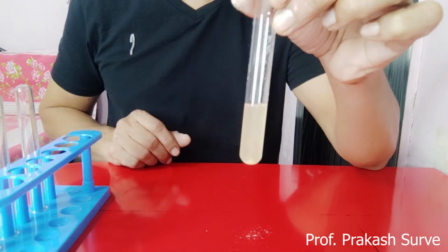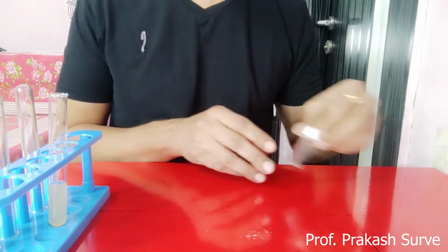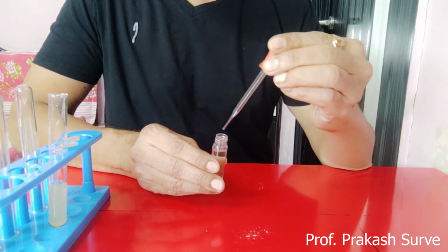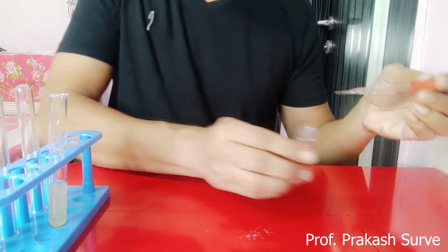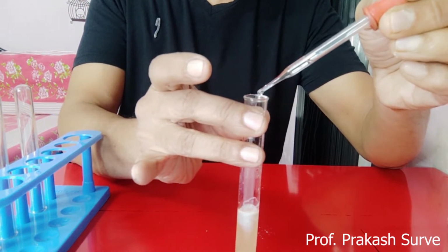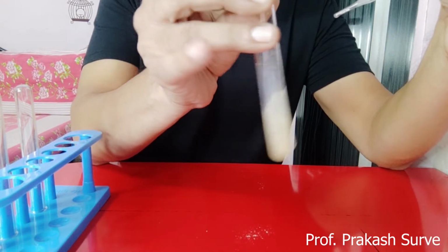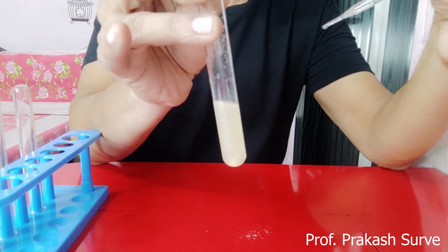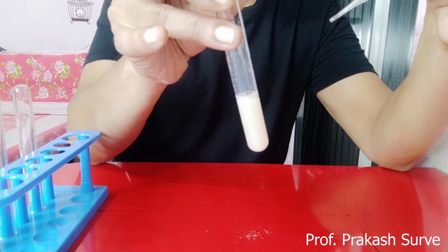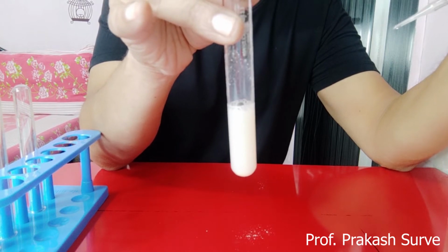Now in this I will add a few drops of the phenolphthalein indicator. Few drops means 1 or 2 drops. So here I will take the dropper and add 1 or 2 drops of the phenolphthalein indicator. Then we'll shake it and see what result we are getting. We'll keep it for a few minutes. After a few minutes we'll get the result.